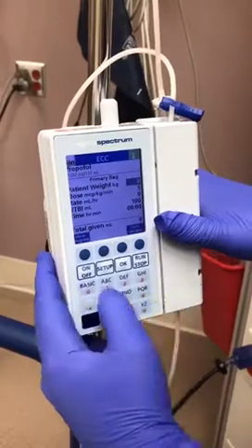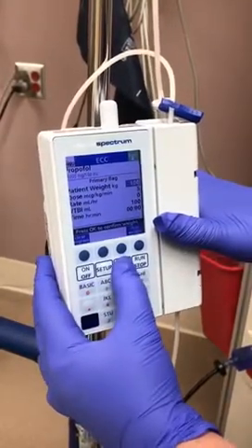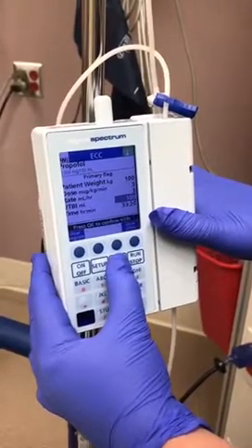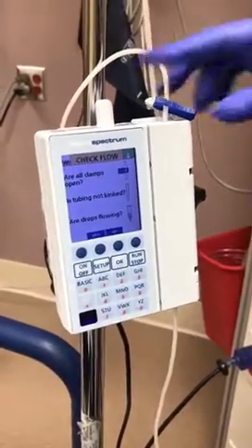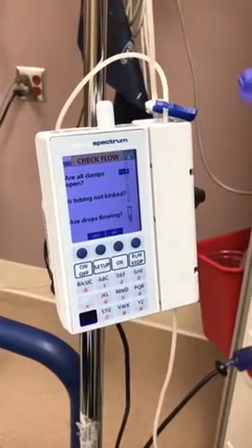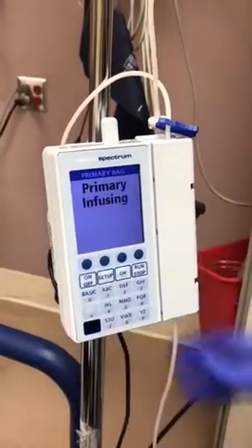My patient is 100 kilograms, and I'm going to start this continuous infusion off at 5 micrograms per kilogram per minute. So I'm going to check my flow, look at my clamps. I'm going to validate that the drips are flowing, nothing's kinked, and I'm going to hit yes.